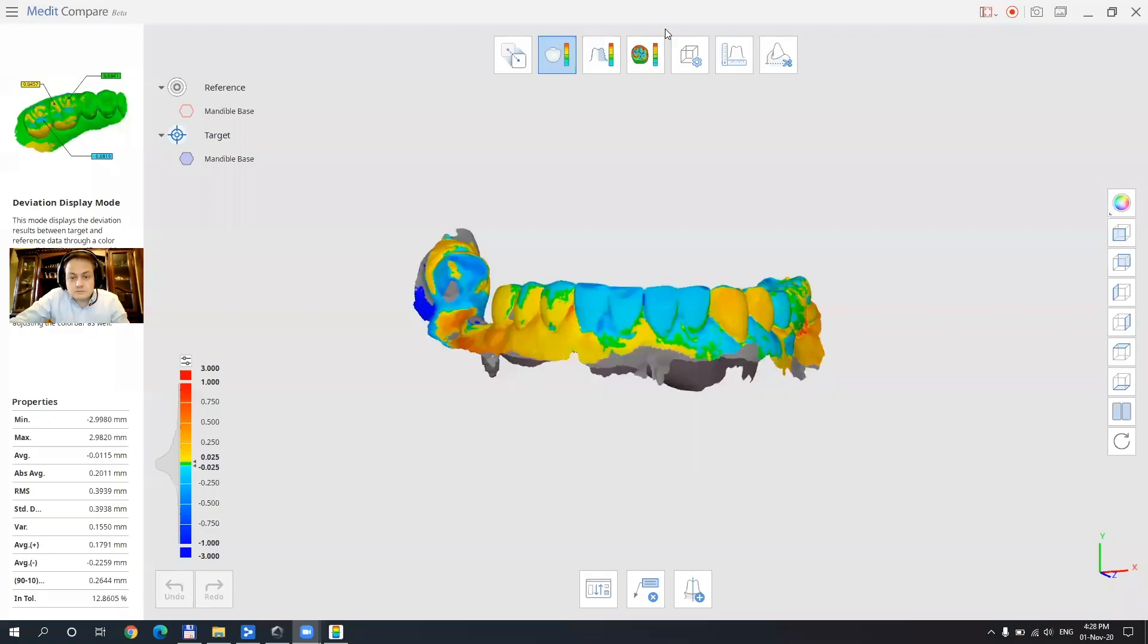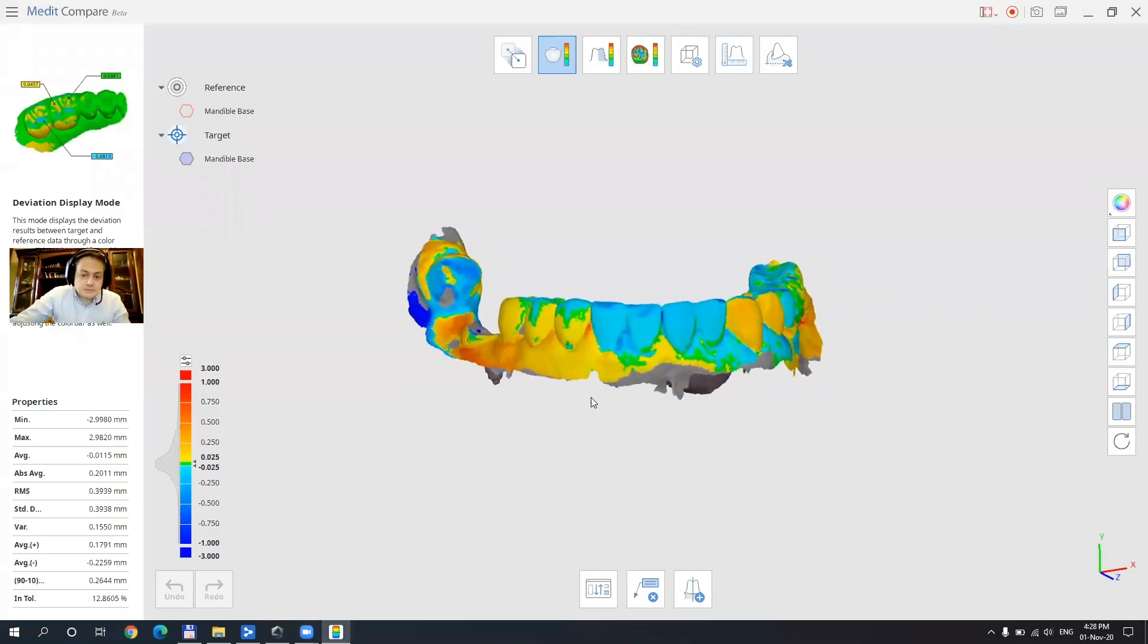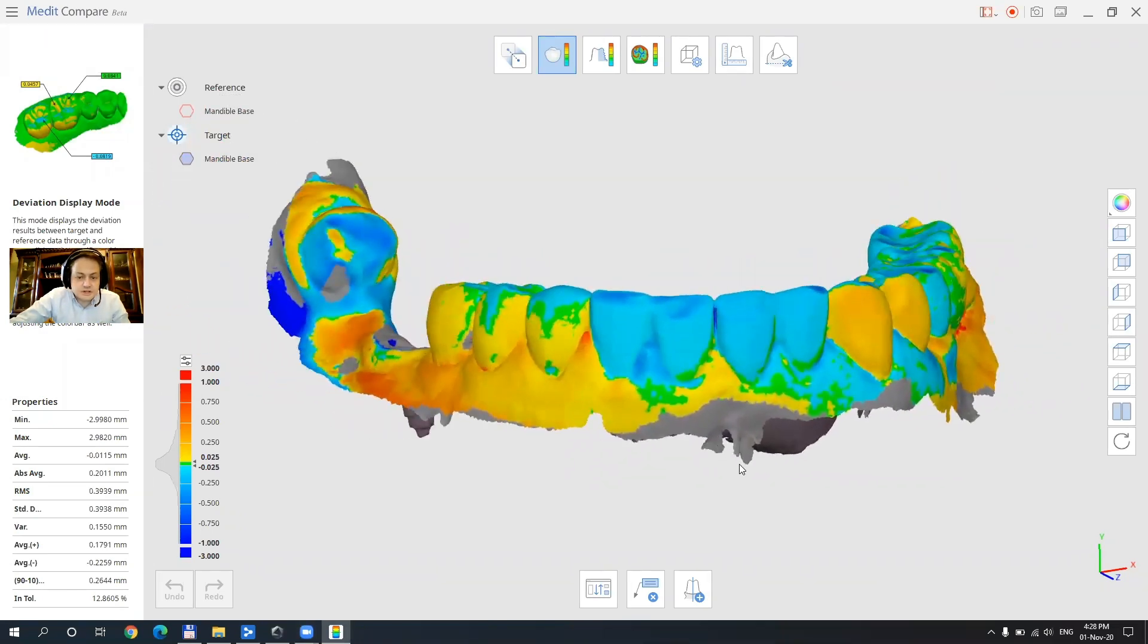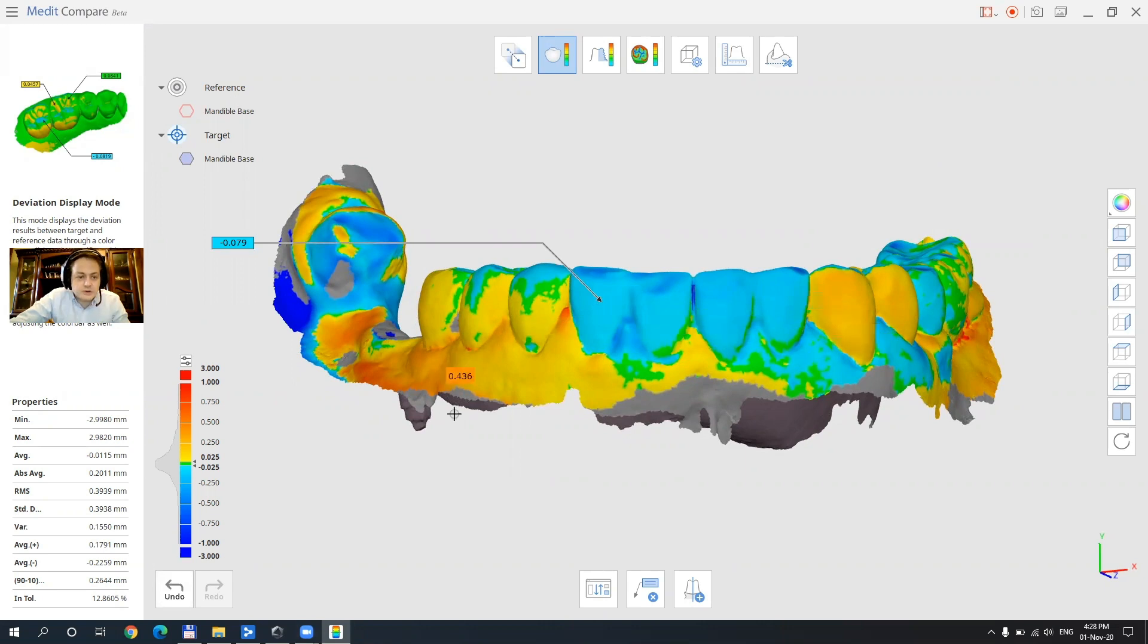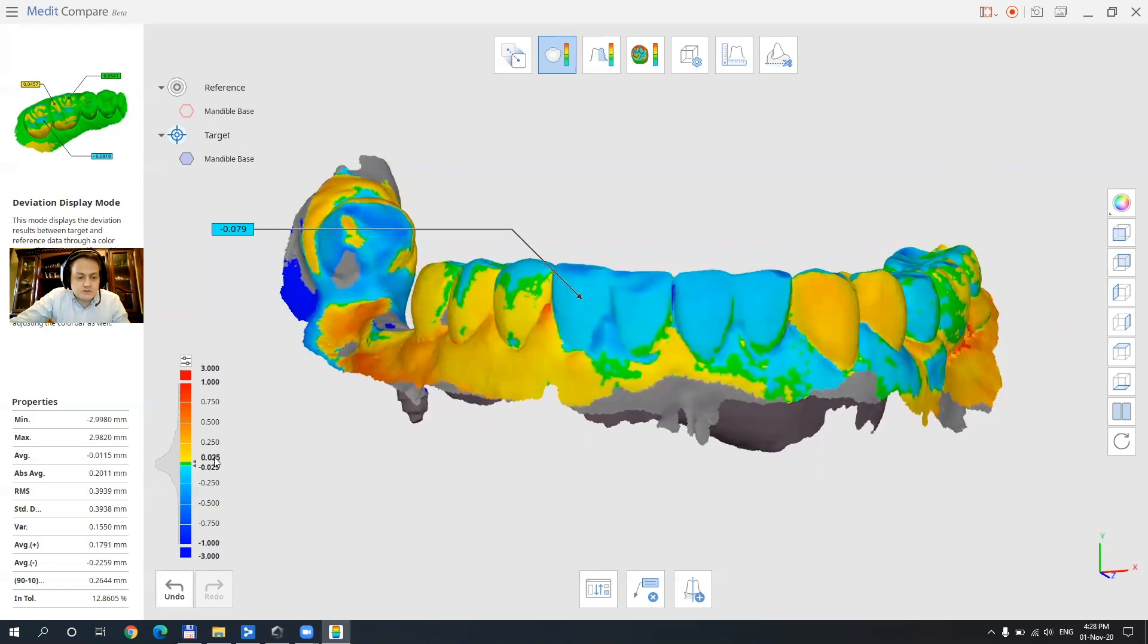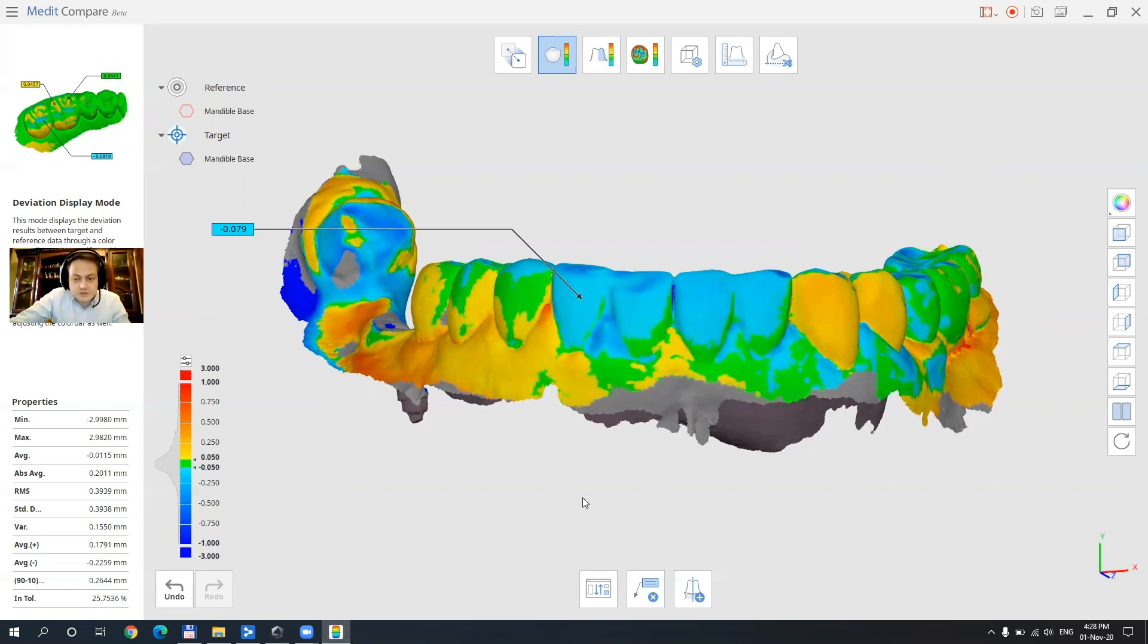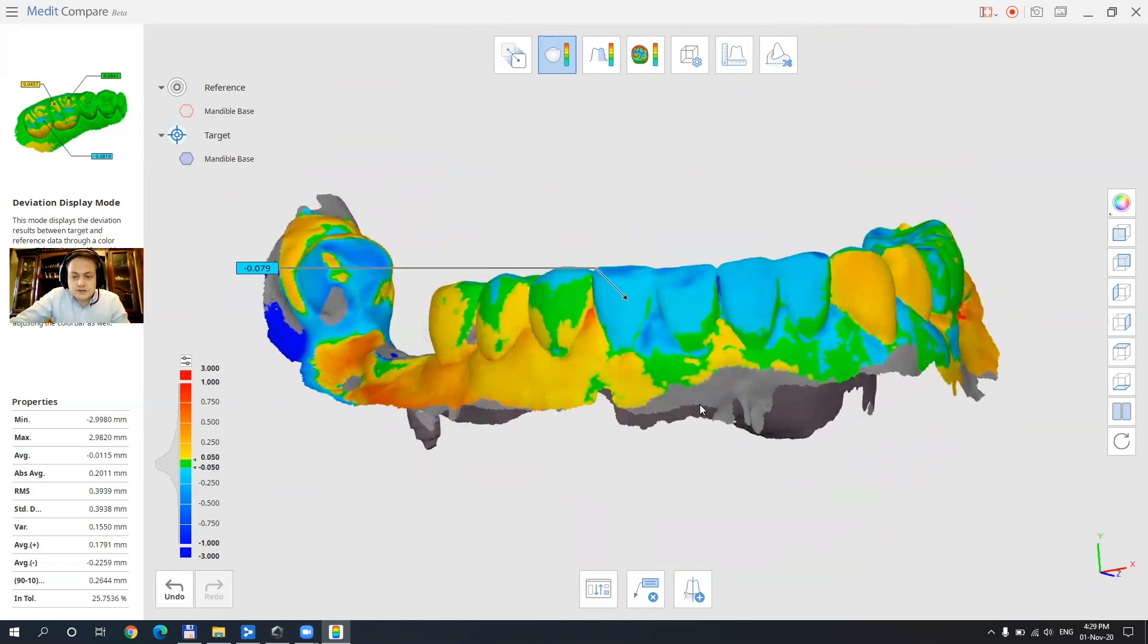And so here we can further see that we have some common areas and some areas that are not the same. Let's just see how discrepant they are. By clicking on them we're gonna see the deviation measured and also colored with different colors. Green is a very high precision and the models are the same and we have positives and negatives. We can also modify these numbers the green numbers just by double clicking. Let's try with the 15 microns setting for positive and negative and already they start to show more of a green arch.